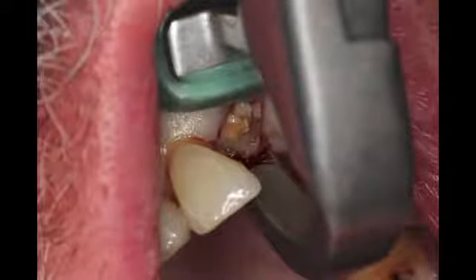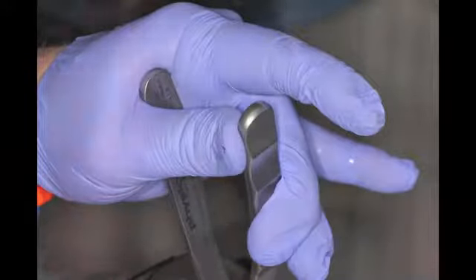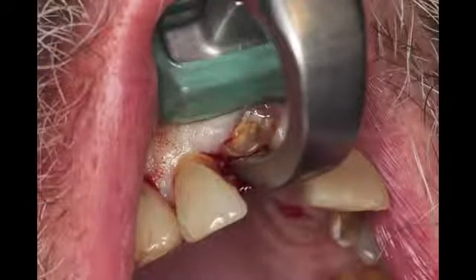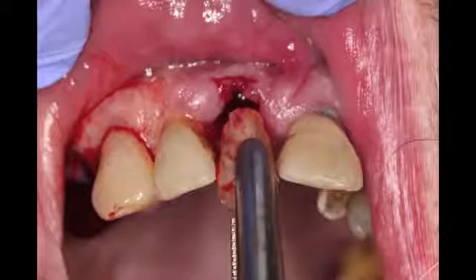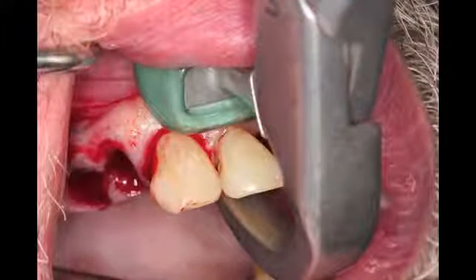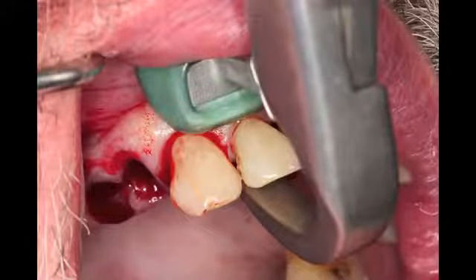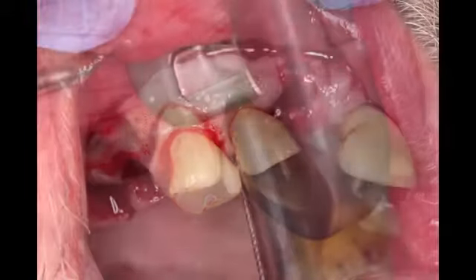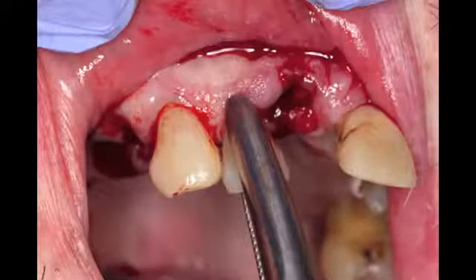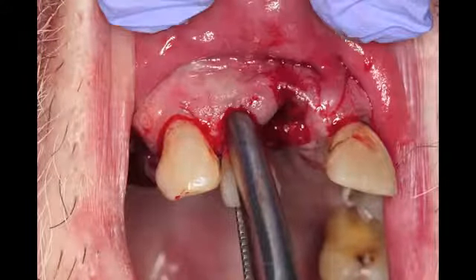I'm going to maintain 2 teeth on the upper jaw, but again, we're not squeezing the instrument. I'm simply holding the handles, creating tension onto the palatal surface, taking our tooth delivery instrument and simply removing a tooth from the socket. The bumper, again, is just a fulcrum. The tooth will disengage from the tension of the beak up and out of the socket, take our tooth delivery instrument, and simply remove the tooth from the socket, maintaining that facial plate of bone very, very nicely.